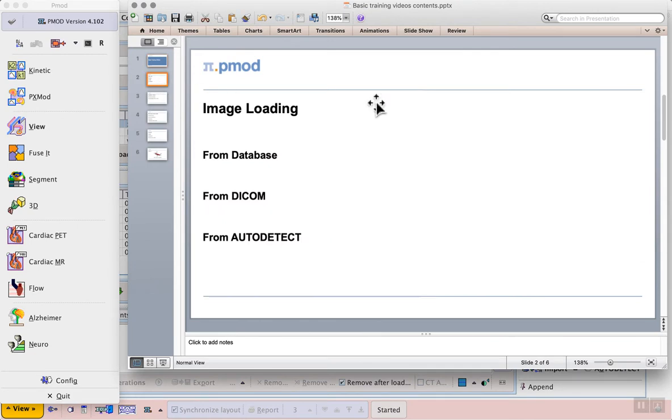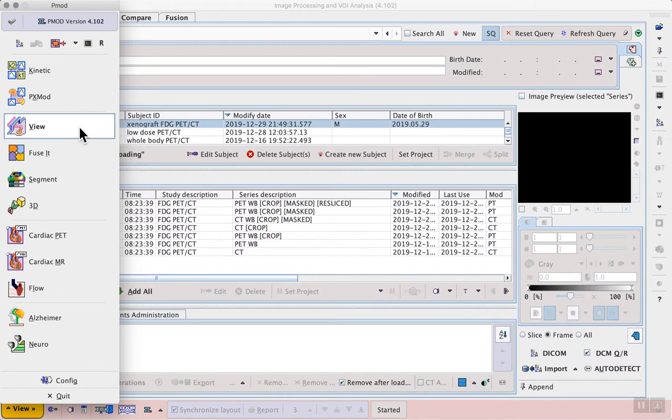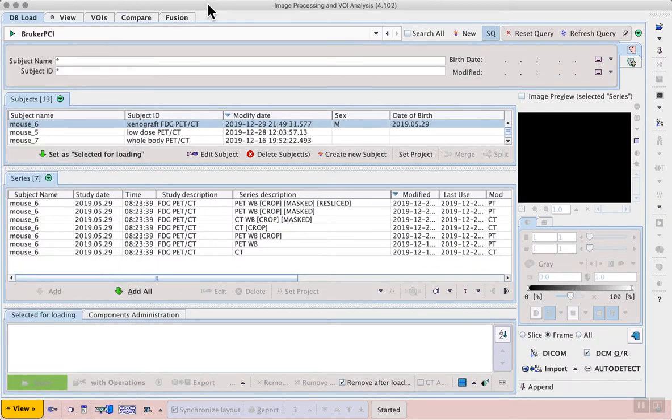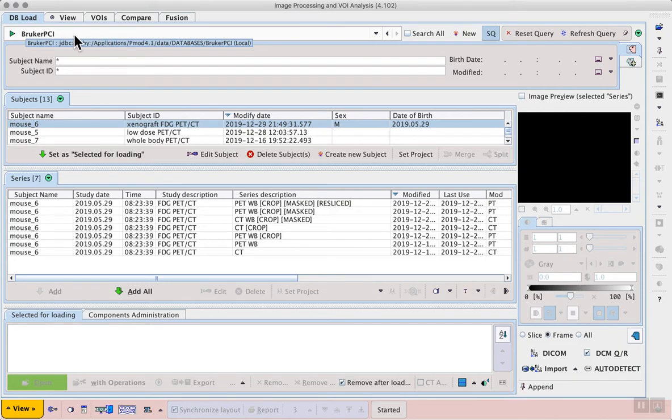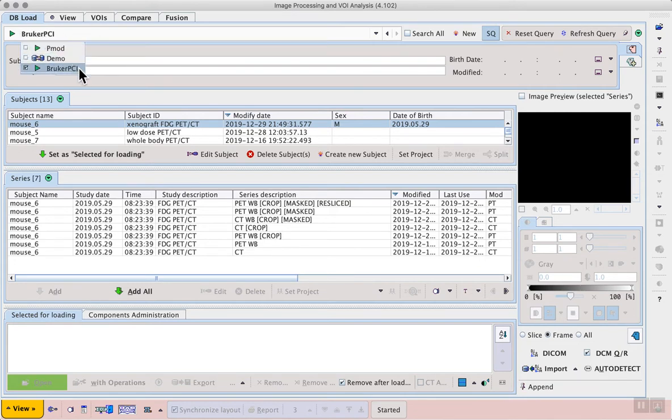In this video we'll look at image loading and we'll start by looking at loading from the inbuilt DICOM database. In this case we start with the view tool and on the dbload page in the top line we can choose the database we want to work with, in this case the Bruker PCI database.